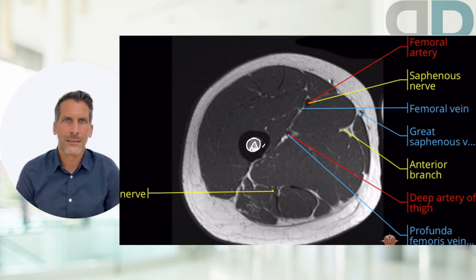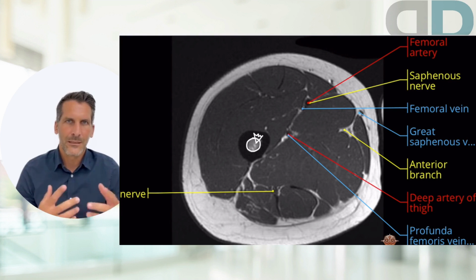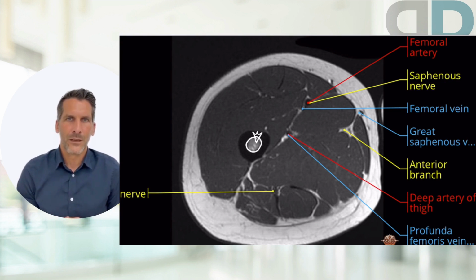The most important thing is a custom-made special saw, which is prefabricated for different medullary cavity sizes and has an eccentrically positioned saw blade. Schematically, they have a guide piston that exactly fits the diameter of the medullary cavity and corresponding saws that can be unfolded. These saws then remove a little more of the bone wall, with each unfolding until it is completely severed. This spares the surrounding tissue and avoids serious complications that could otherwise arise from an external cut.